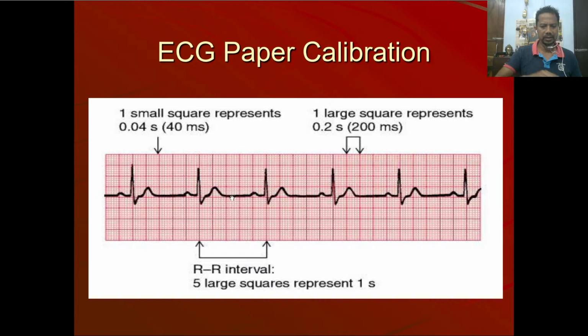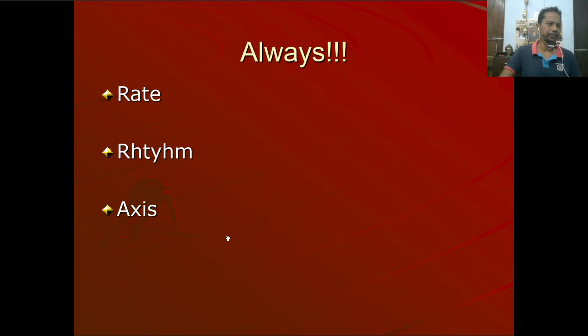So you might see this type of ECG pattern. So it will be difficult for you. So then you have to make sure the grounding is good and the patient is grounded properly on the bed, and after the heart rate settles down, you can take another ECG just for teaching purposes, like that.